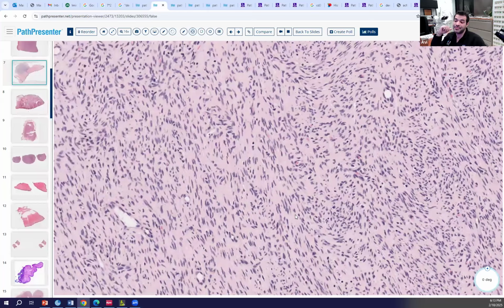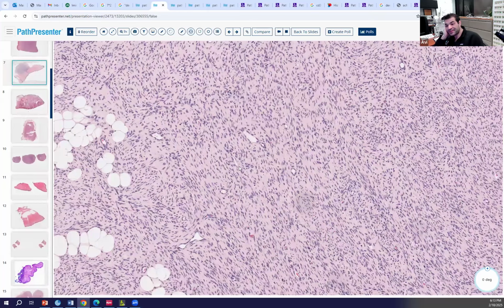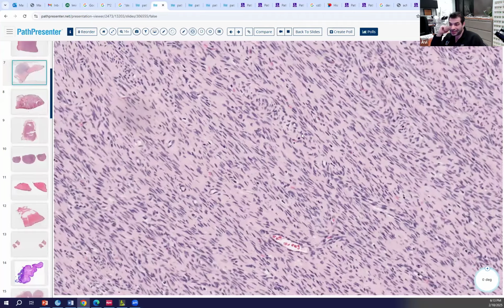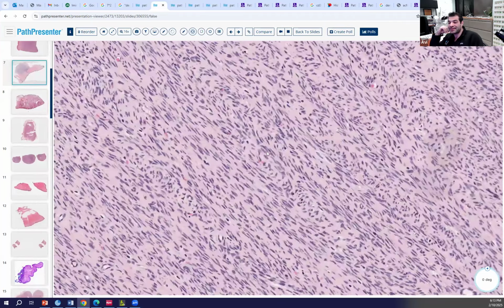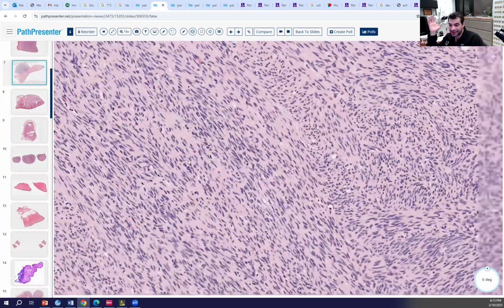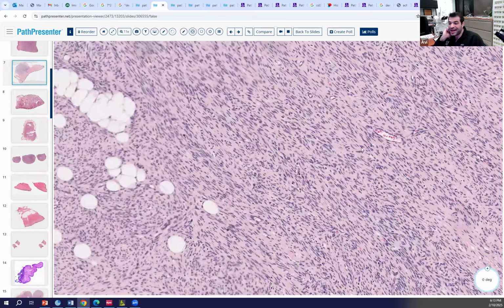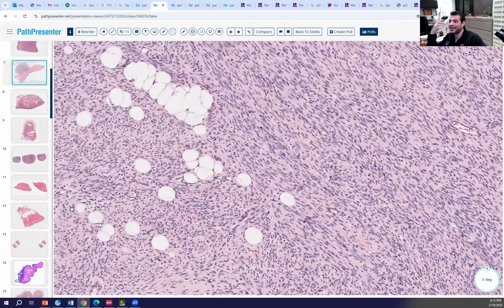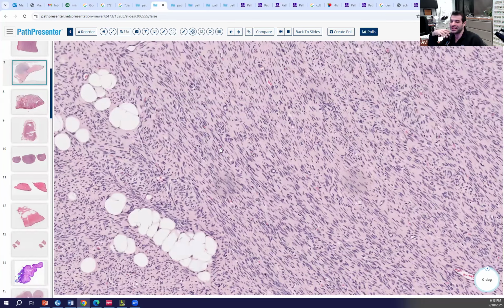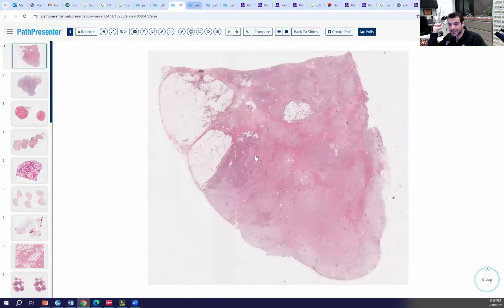In this case, sometimes you can get a fibrosarcomatous DFSP. We can see like a herringbone kind of look to it. But the point is that these are bland fascicles. It's a fascicular growth pattern, and the nuclei are basically in a row. They're not haphazard. There's an organization to it. These nuclei are not just randomly floating about. But let's go to the neurofibroma now.